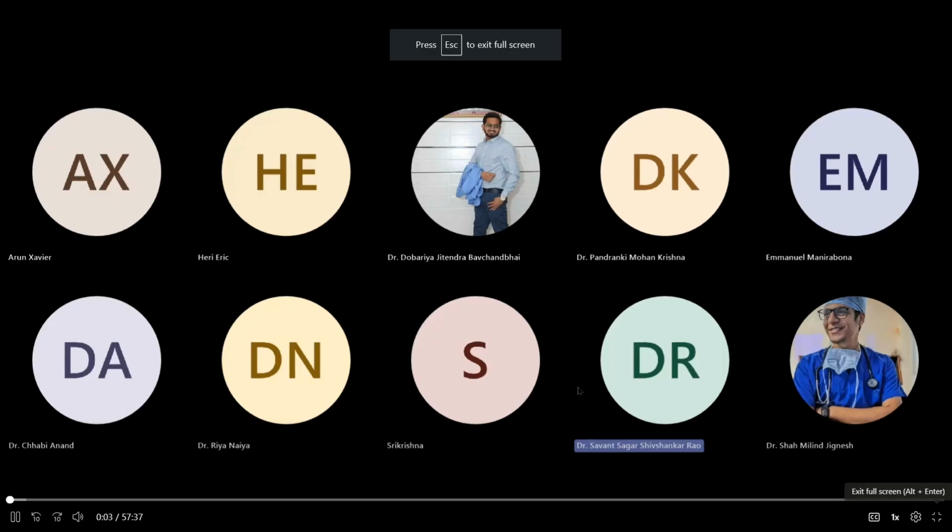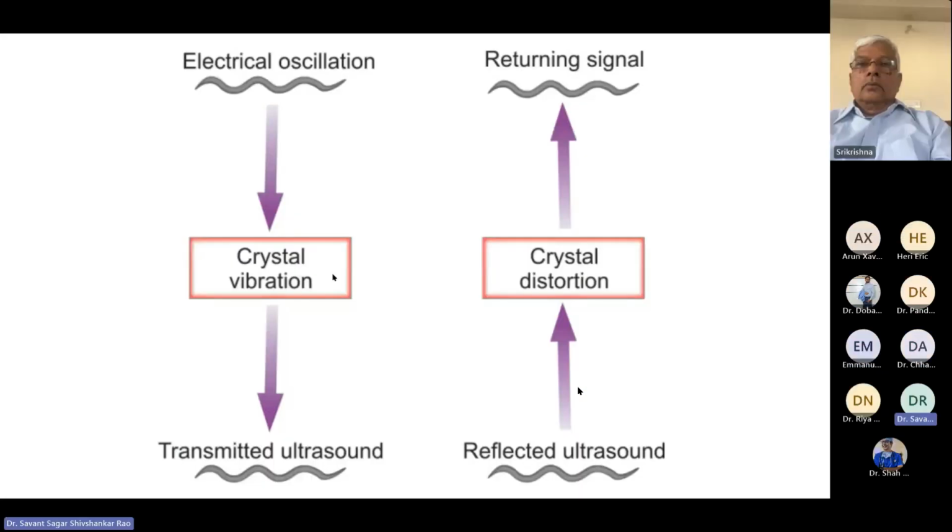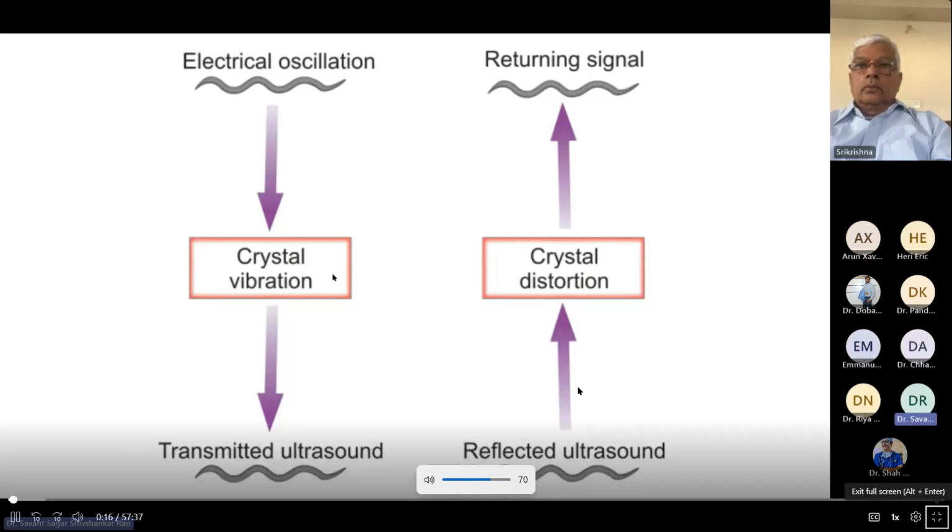These generate ultrasound waves, which are transmitted through the body of the transducer, which houses several such crystals. Most of these ultrasound waves are scattered or absorbed by the tissue without any obvious effect. Only a few waves are reflected back to the transducer and echoed.